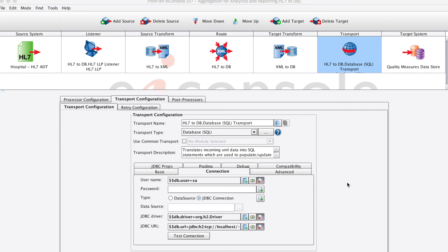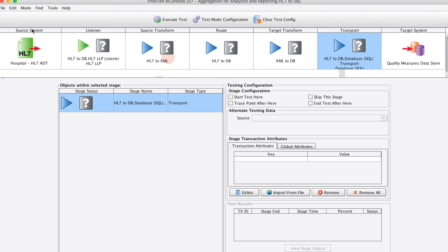Now that we view the configuration of these stages, let's move along to testing mode to see it in action. Here, we'll see all the stages that we just talked about represented as question marks. We can choose to start our tests at any stage and end it at any stage.